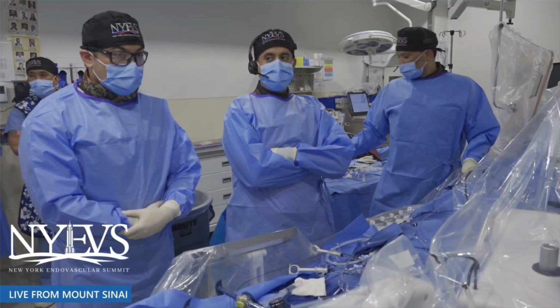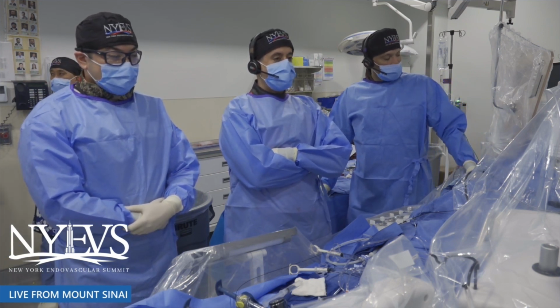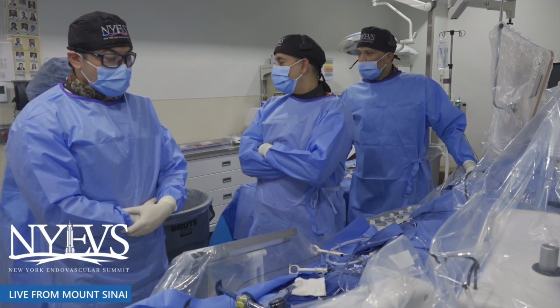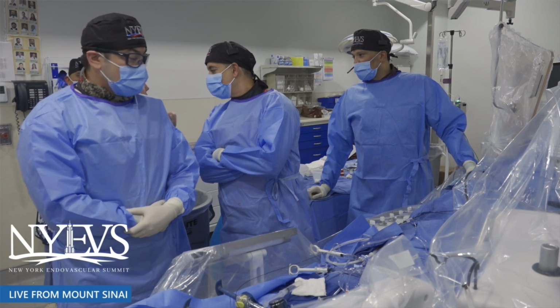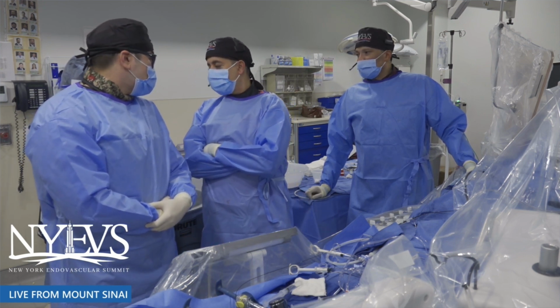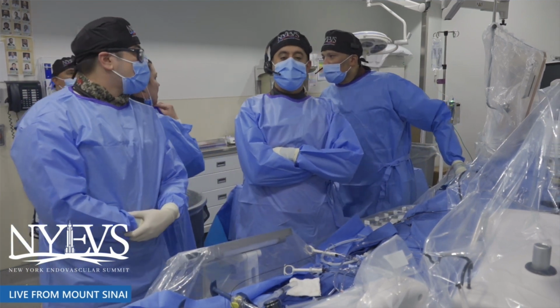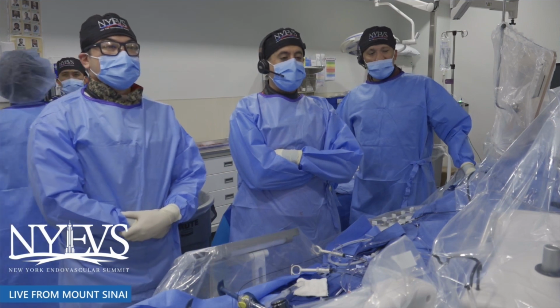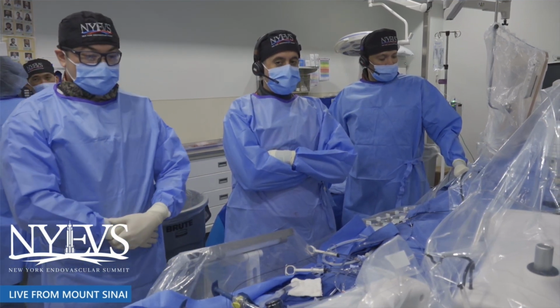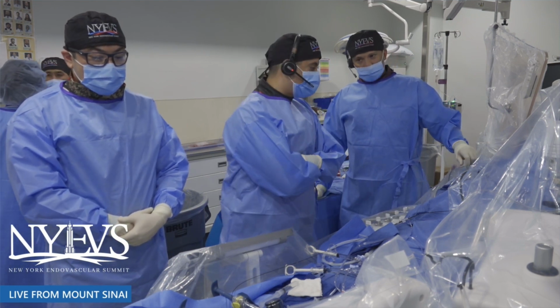If you look at the recent data from the Dutch randomized trial, the Discover trial, and also the data from the COBEST for TASC A and B lesions, there's no real benefit except maybe a lower risk of embolization and perforation. But if you perform your measuring up front or during the procedure properly, then the risk of perforation is very low. If you would use IVL, then the question is, are you going to use a kissing IVL or are you doing a sequential IVL?